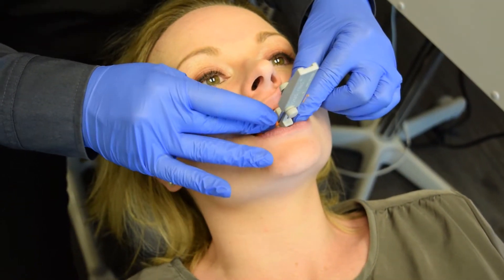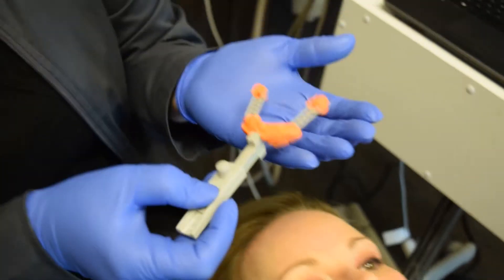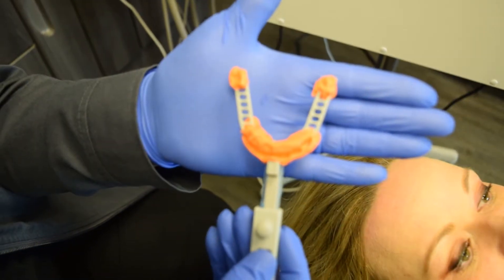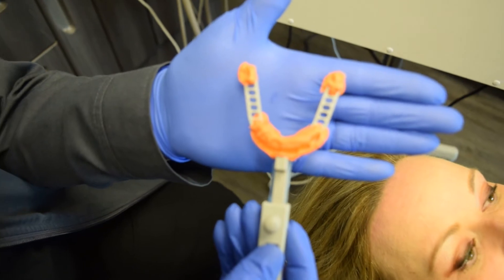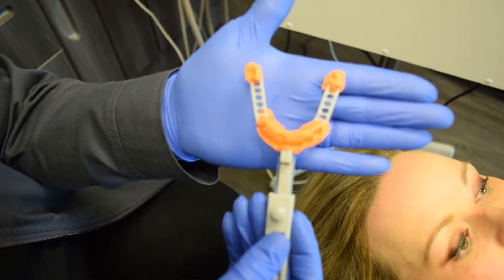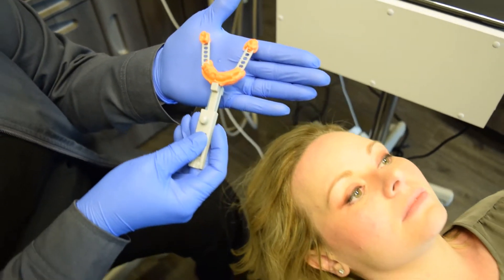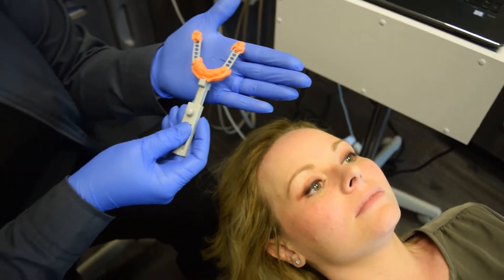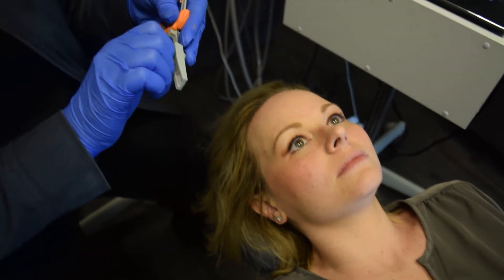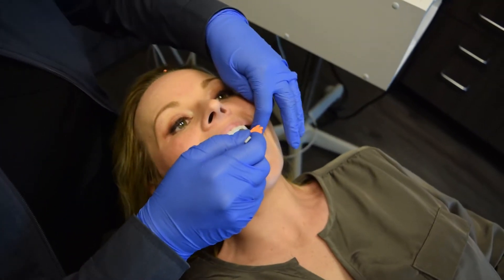You can see as we remove this and look here, you can see the indentations of the teeth in the second molar and the front six teeth through the cuspids. Now we're going to disassemble this and place this to do a scan bite of a digital impression. From there it makes it very easy because you've got a stable bite, with second molars being stable as well. So we take the George gauge off and place the bite back in — this is the obite here.